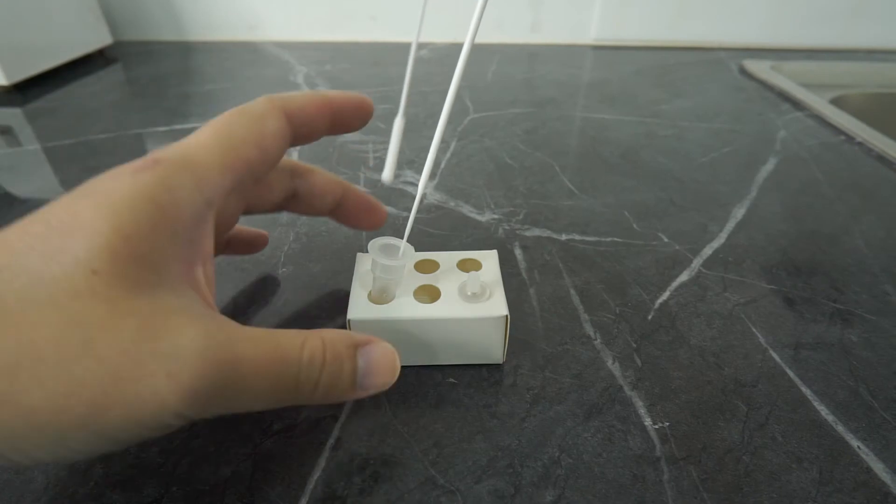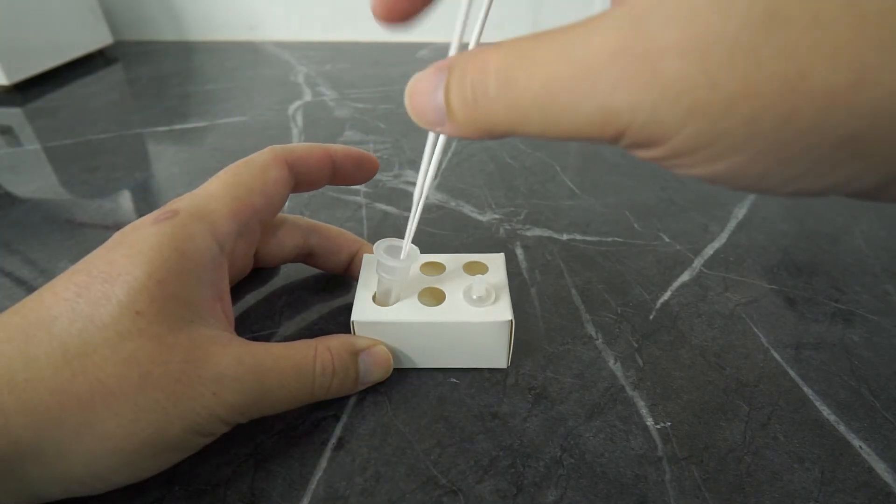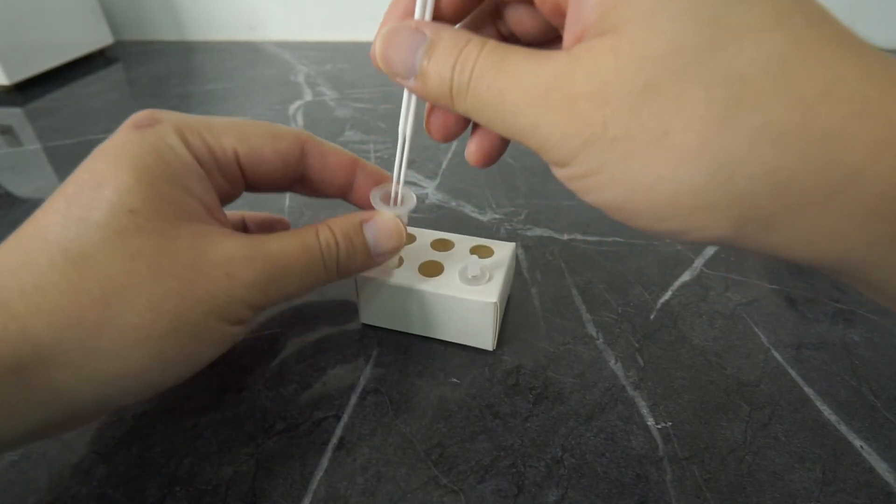Now we start the nasal swabbing. Insert only the fabric tip of the swab gently into one nostril until you feel a slight resistance, about 2 cm up into your nose. Roll the swab around the inside of the nostril making five complete circles. Then repeat the same steps with the other nostril. After you're done, put swab number two into the same extraction tube.